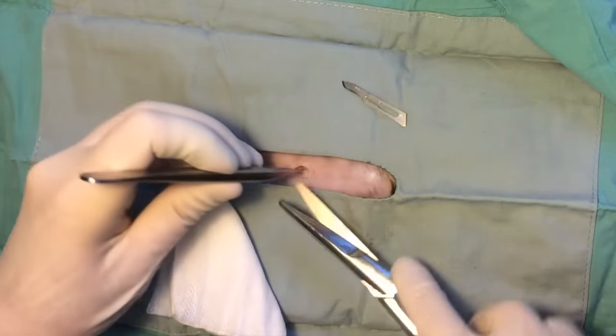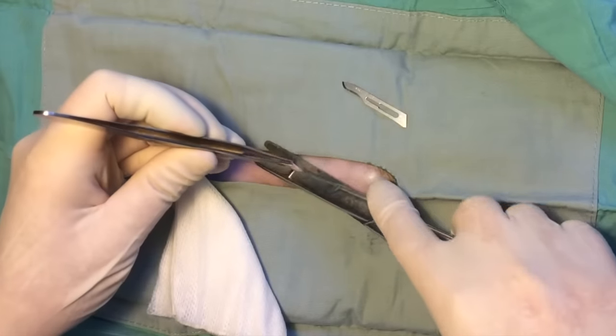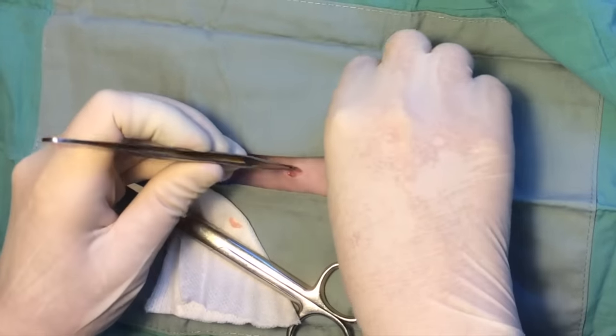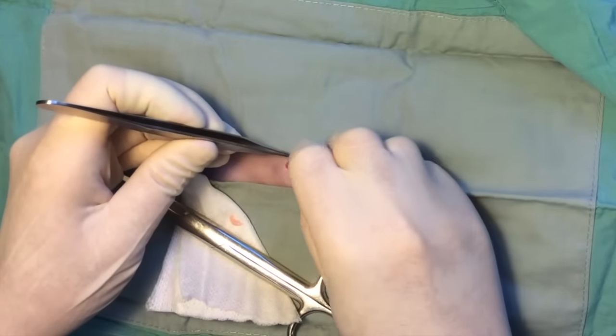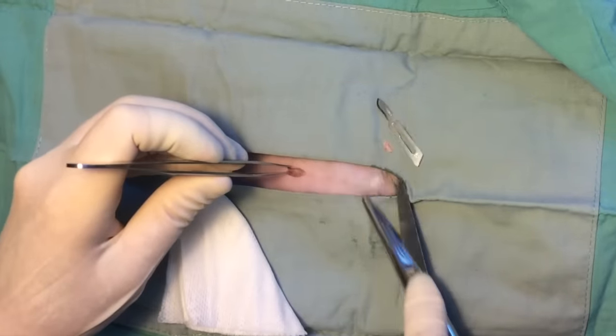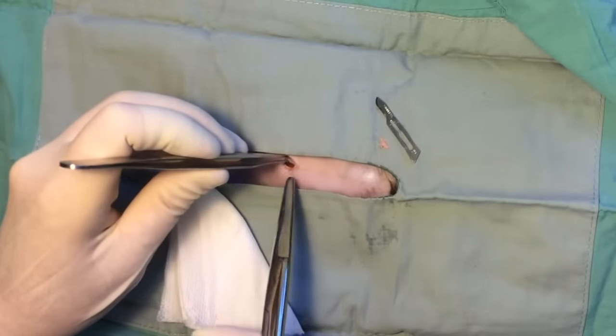Subcutaneous fat is bluntly dissected or removed with scissors to allow visualization of the linea. The body wall is tented with a thumb forceps and a surgical blade is used to make a stab incision into the abdomen, taking care to avoid abdominal contents. The incision is extended bluntly with scissors.